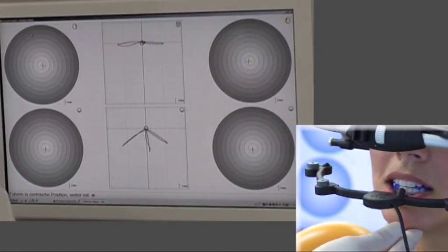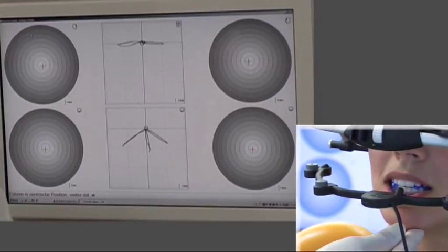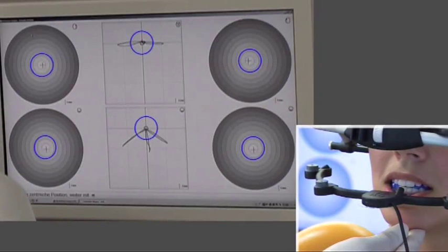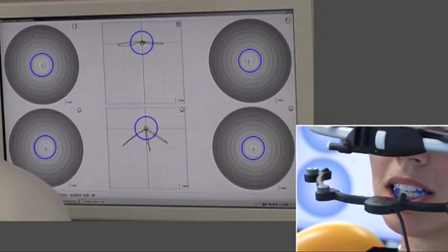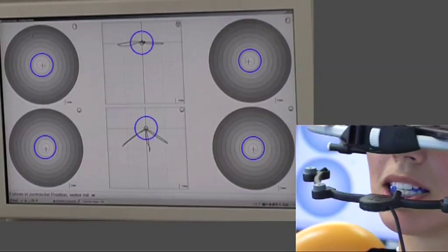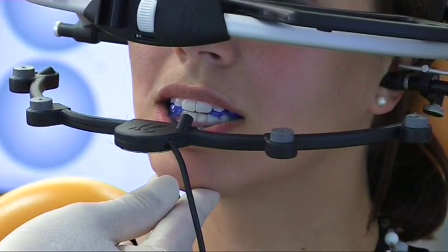I restart the module and see the actual position of the support pin and the condyle as red crosses. These crosses should be at the centre point of the green circles or the condyle position display. If this is not the case I can correct the lower jaw position during this current procedure so that the previously determined centric position is recovered.